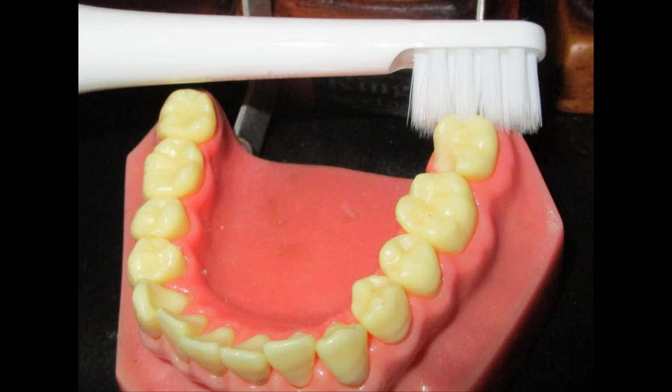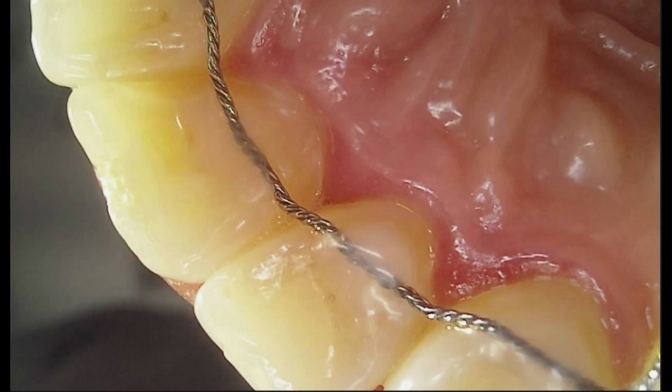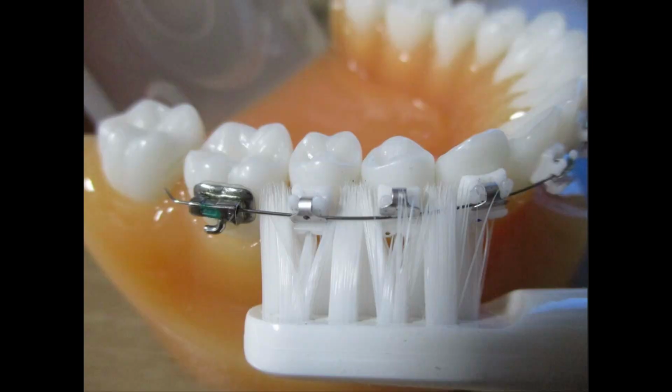You can brush the posterior surfaces of your last molars more effectively with an electric toothbrush without irritating the mouth corner. As a result, the risk of angular cheilitis is minimized. Crowded or malaligned teeth are not easy to be cleaned well with a manual toothbrush. Orthodontic braces or retaining wires make toothbrushing very difficult. You can brush them more conveniently with an electric toothbrush.